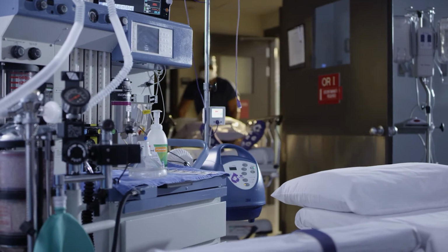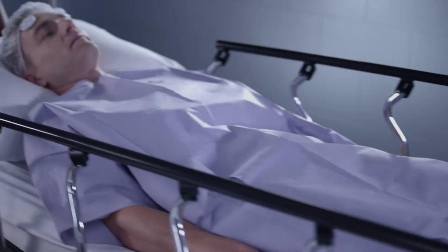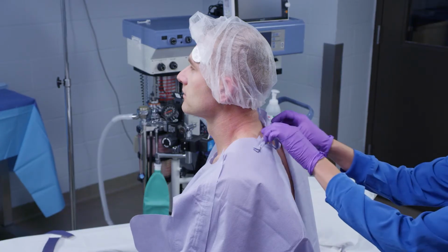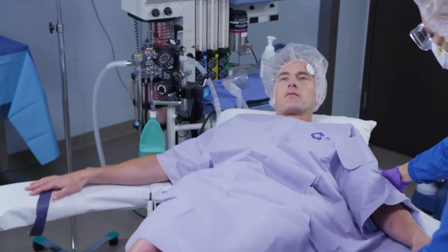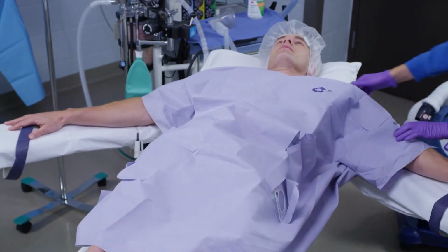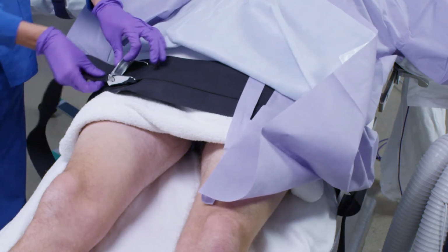Patients wearing 3M Bair Hugger gowns arrive in the OR with all the warming tools the surgical team needs for multiple positions and orientations. For easier gown positioning, untie the side and neckties and open the gown in the back prior to placing the patient on the OR table. Extend the gown to its full length for optimal heat transfer. Make sure the safety belt is not over the portion of the gown that will be inflated or rolled up.